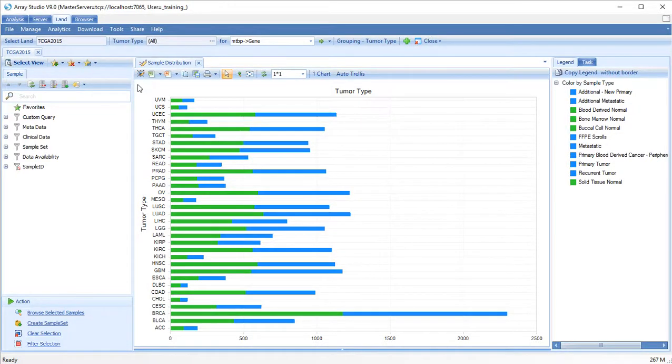Breast cancers that do not express estrogen receptor, progesterone receptor, and EGF receptor or HER2 cannot be targeted by many of the common treatments for breast cancer, so are of particular interest. We can use TCGA clinical metadata to identify so-called triple-negative breast cancer or TNBC samples.